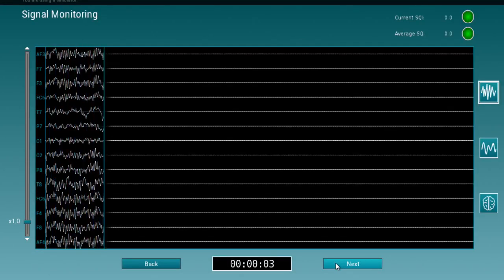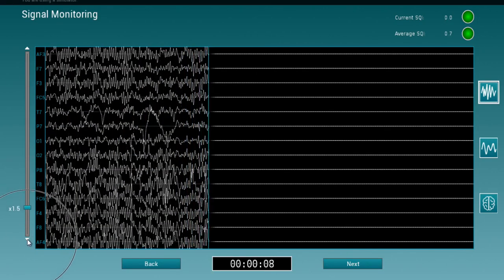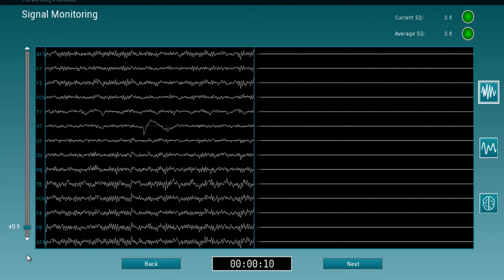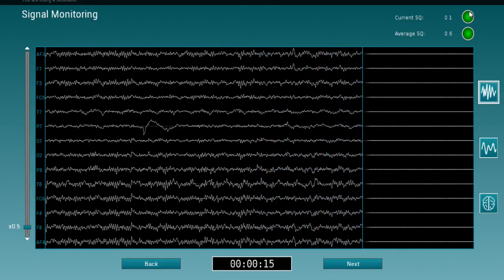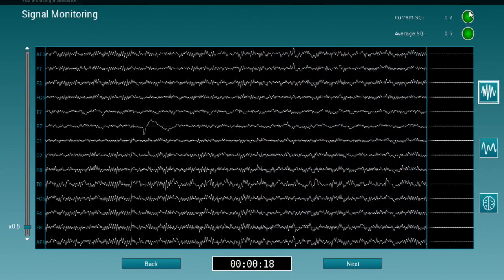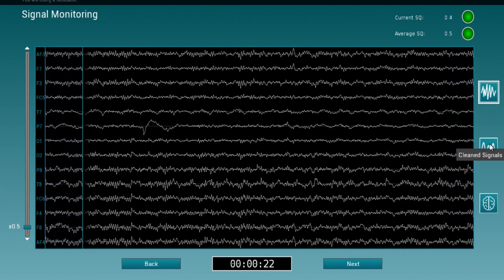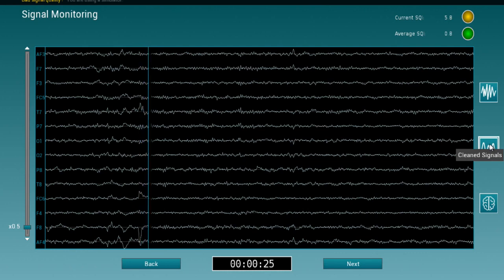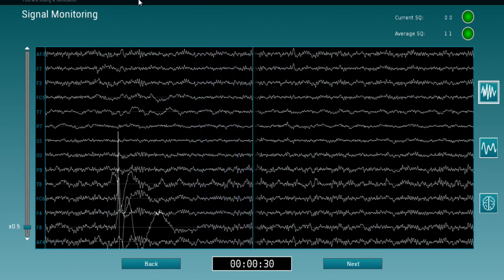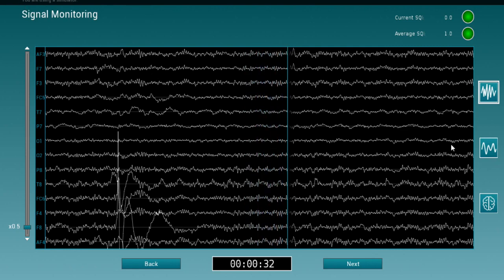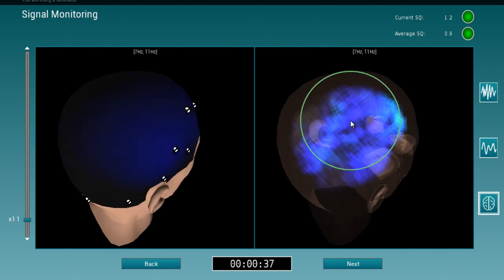The first screen is going to show the raw data. You can modulate the signals using the button on the left-hand side. On the top right-hand side you have the current signal quality index as well as the average quality index on the data. You can look at the clean signals after artifact removal, and there is an indicator for signal quality when you have huge artifacts. If you'd like to look at topographic views, this is also possible.